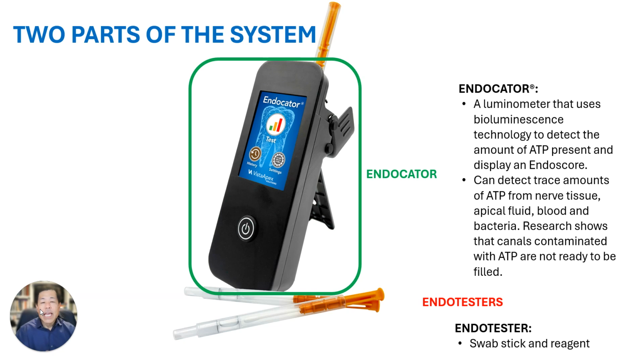It doesn't matter. If we leave any of that cellular debris behind, that root canal may fail, because research has shown that canals contaminated with ATP are not ready to be filled. So this is a great tool.